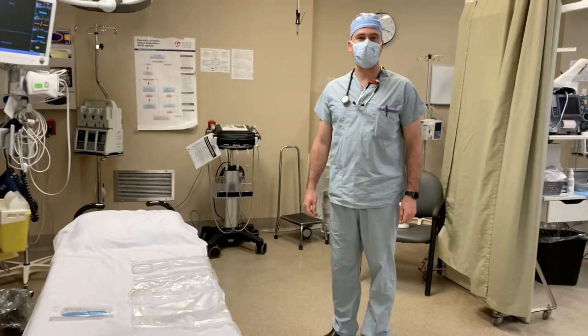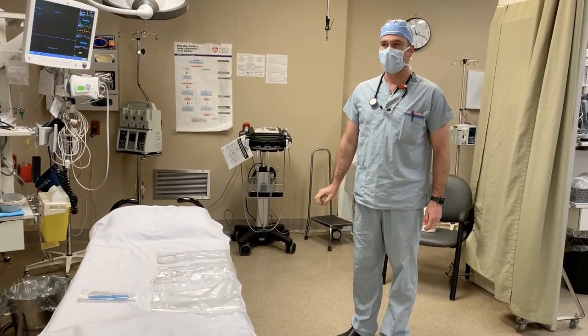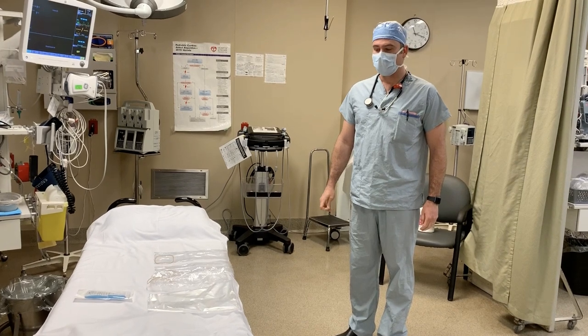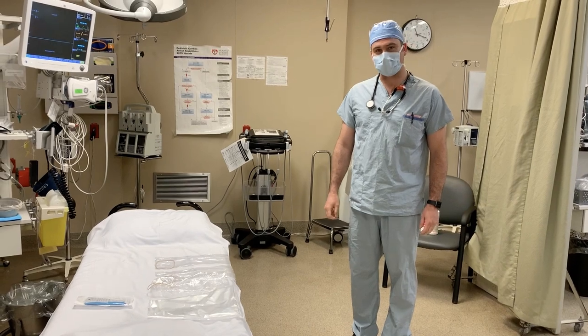Hi, I'm Mike. I'm one of the emergency room physicians at the Monkham Hospital, and I'm here to show you an approach to protecting your ultrasound machine while using it on patients who are suspect COVID.